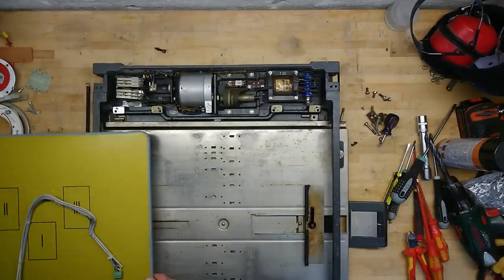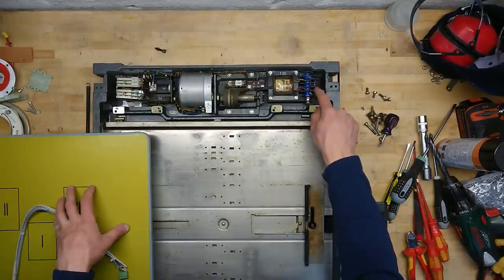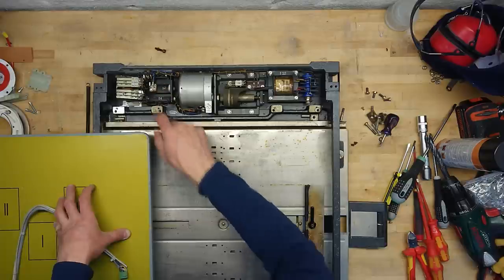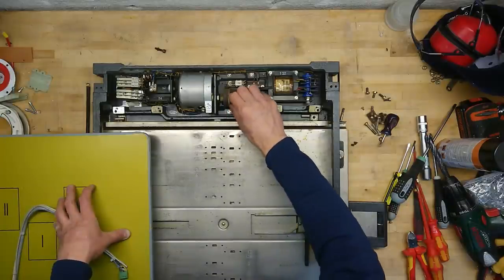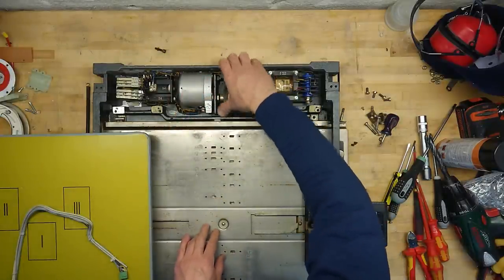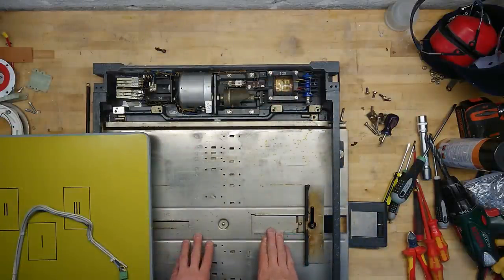Now the motor drive itself over here has a little transformer that drives a full-bridge silicon output rectifier here. Goes backwards over to these open relays that drive the motor through a couple of resistors. Also says revision 44, so that design has gone through quite a lot of phases. But it's a nice gear motor, so I think I'm keeping that for sure. Maybe even for a coil winder. Depends how fast it runs and at what voltage, because that is probably something like 115 volt AC. Oh yeah, no. Should be a DC motor. Yeah, so.